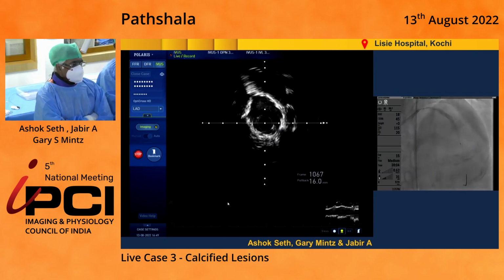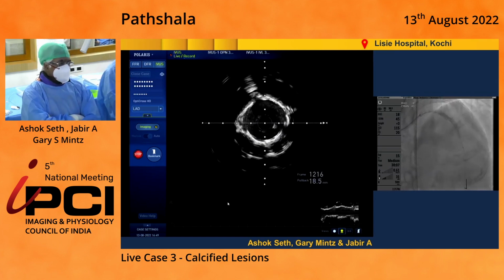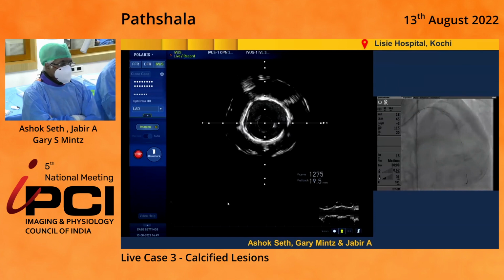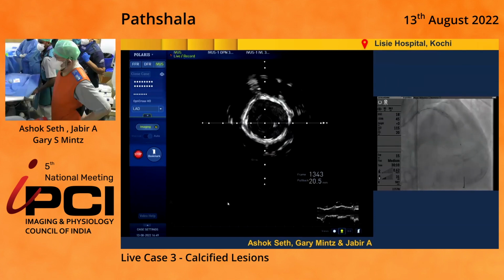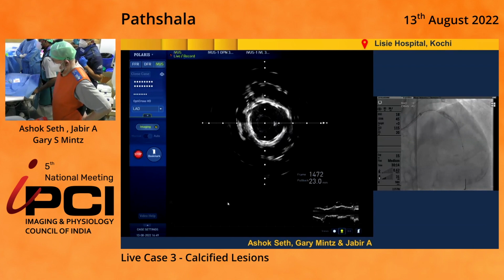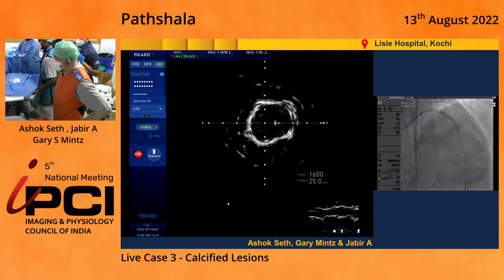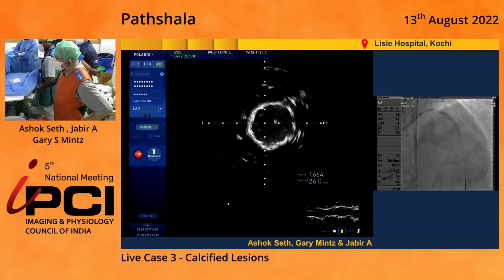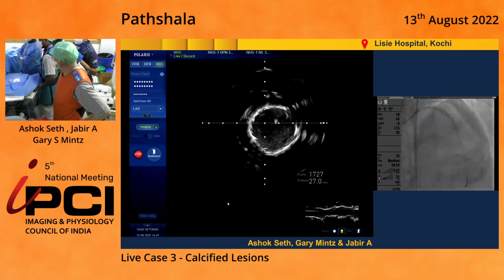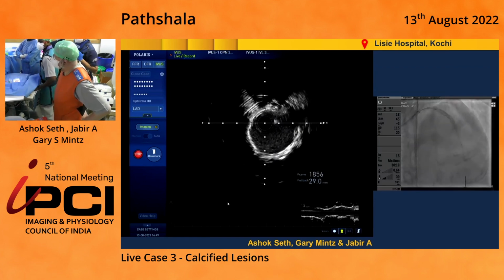Okay, now we're seeing where we are. Gary, your comments. I'll obviously stop and measure. It looks a little better. It doesn't look a lot better. So this is the time to look at the MSAs, isn't it? Correct. My eyes are not that good, so I always stop to measure, because I can be wrong. And one square millimeter means a lot.